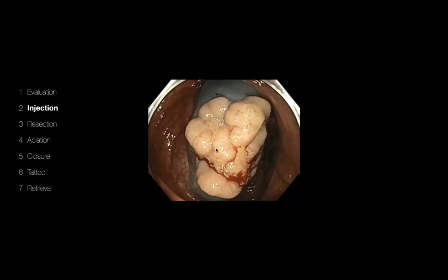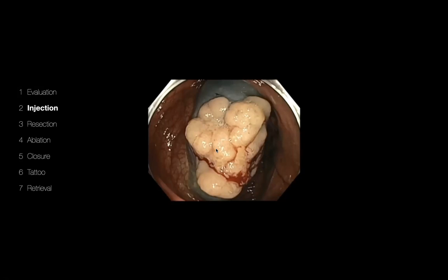And you can see that most of the surface does not show any features of overt cancer in this video. So something to keep in mind. The most important thing from an assistant point of view is to learn to do two things. One is to inject a small aliquot of fluid by tapping on the plunger. And the second one is that the assistant should stop injecting when he or she creates a mucosal bleb.